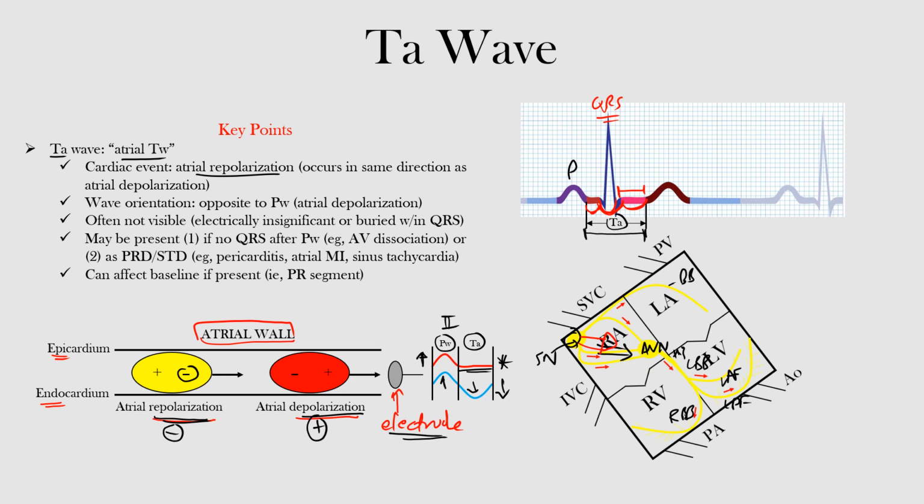So what I'm saying is there's been a lot of debate in the past about whether to use the TP segment, which is from here to this point. This is our T wave, this is our P wave, so this is called the TP segment. Notice it's flat here. Or using the PR segment, which was this to this. Okay, and using it to determine which is our actual baseline to consider for ST depression or ST elevation.